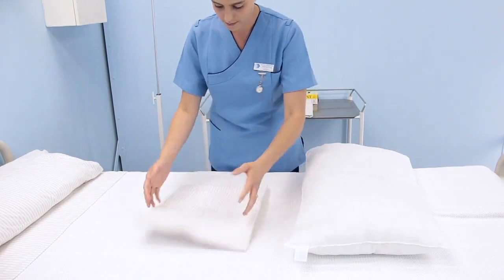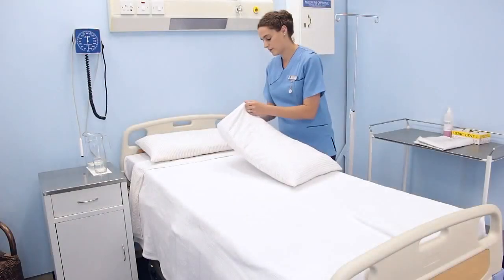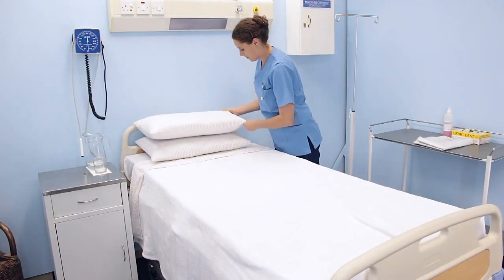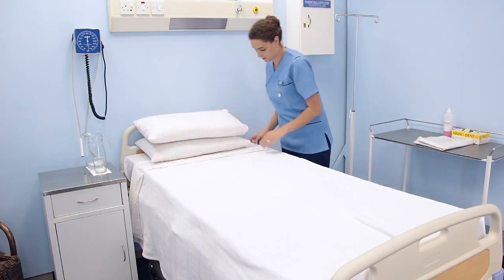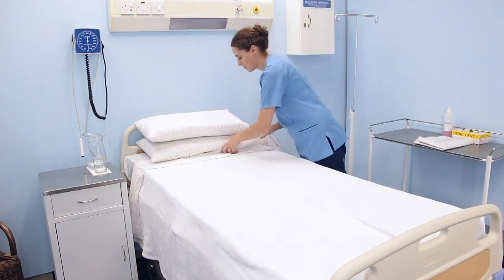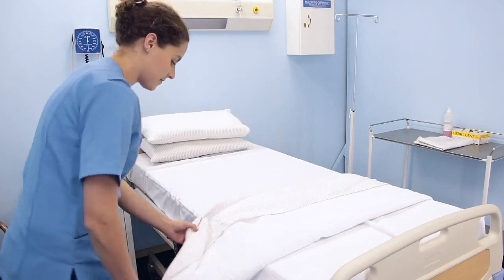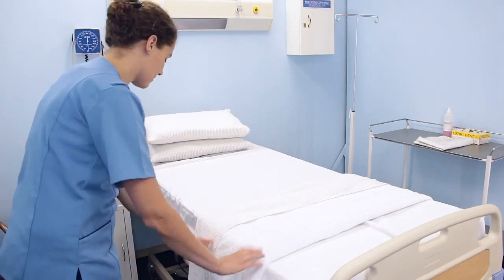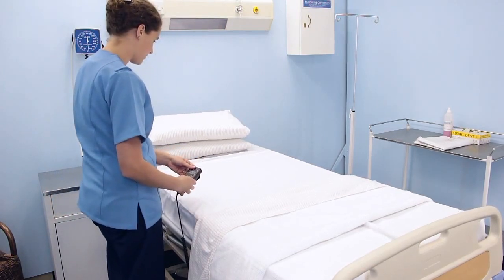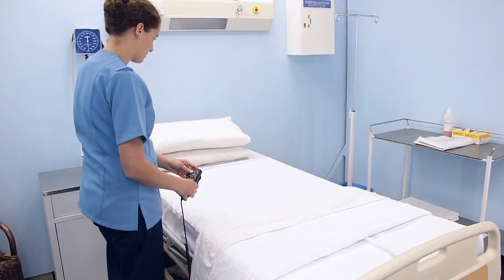Repeat these steps with the rest of the pillows. Place the pillows at the head of the bed with the open ends facing away from the entrance door. If the bed is not in use, leave the top linen closed. If the bed is used by a patient, fan fold the top linen towards the bottom of the bed. This will make it easier for the patient to get into the bed. Adjust the bed to a low position and raise one side rail if required.